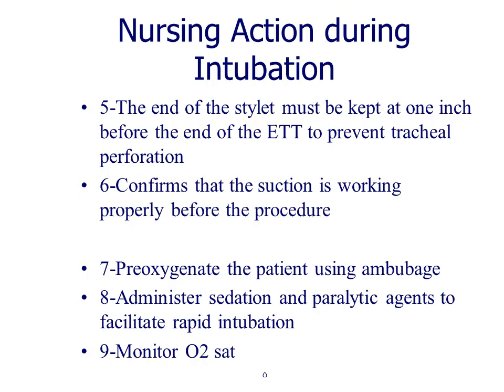Point 6 confirms the suction is working properly before the procedure. Pre-oxygenate the patient using the ambu bag. Administer sedation and paralytic agent to facilitate rapid intubation, and monitor O2 saturation.